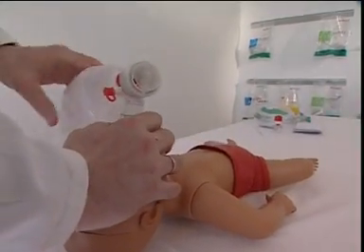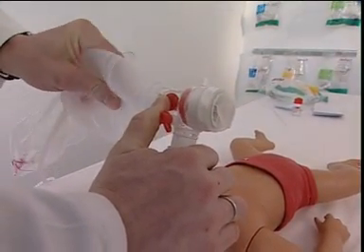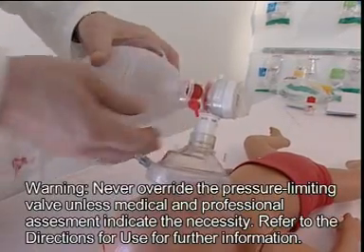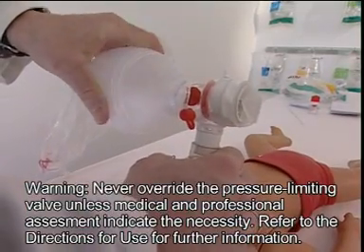To avoid excessive pressure in the lungs, all infant and pediatric versions are equipped with a pressure limiting valve. The pressure limiting valve can be overridden either by putting one finger over the valve or by using the override clip attached above the valve.